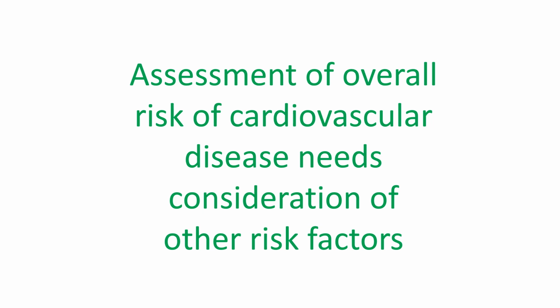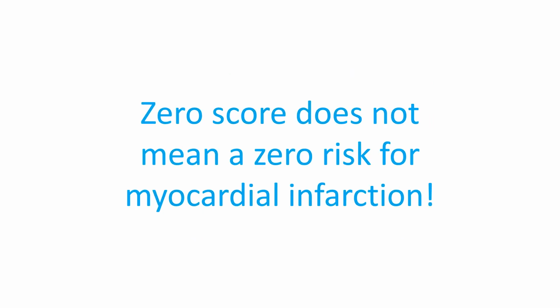All these values are not absolute because it is only a single factor. Other risk factors in the individual have to be assessed by an expert physician to quantify the risk more accurately and take appropriate preventive measures. For that matter, a 0 coronary artery calcium score does not mean a 0 risk for myocardial infarction.